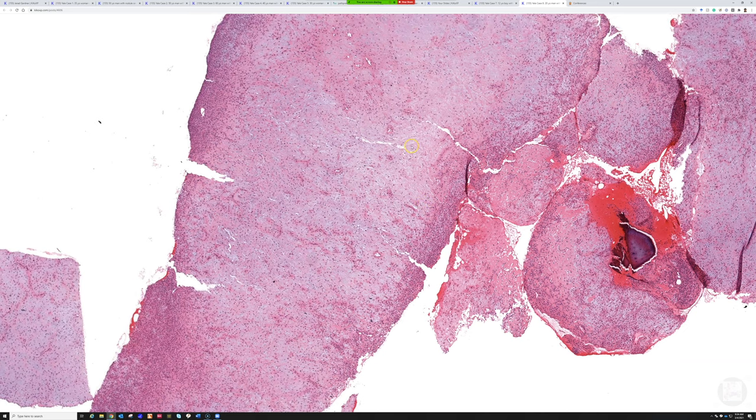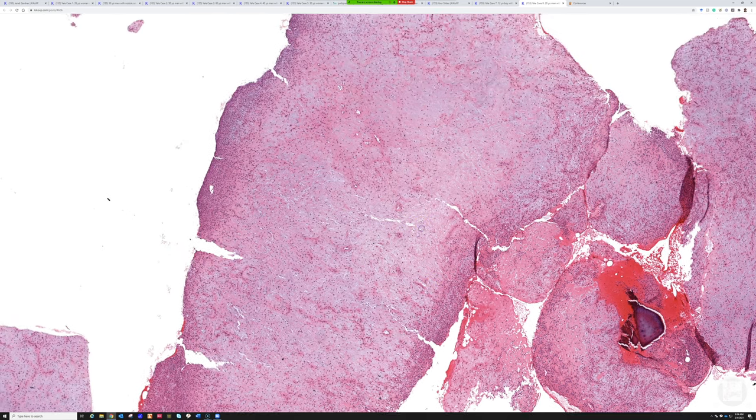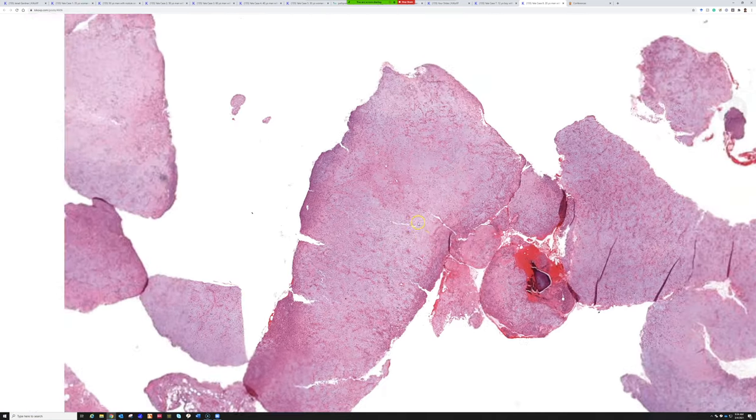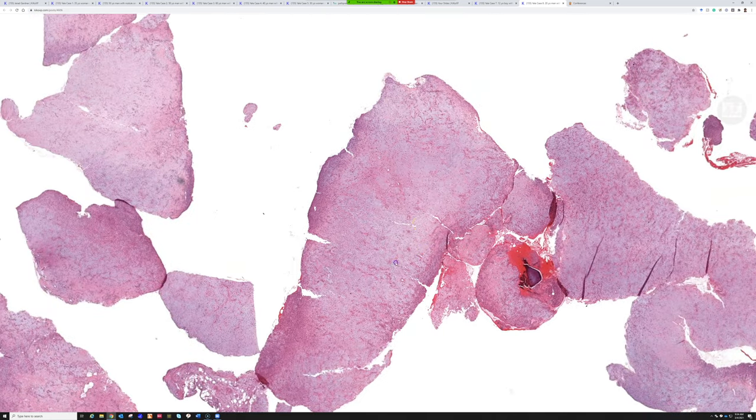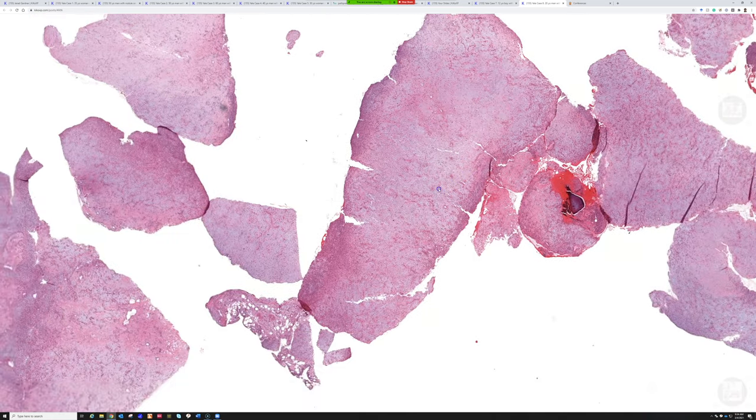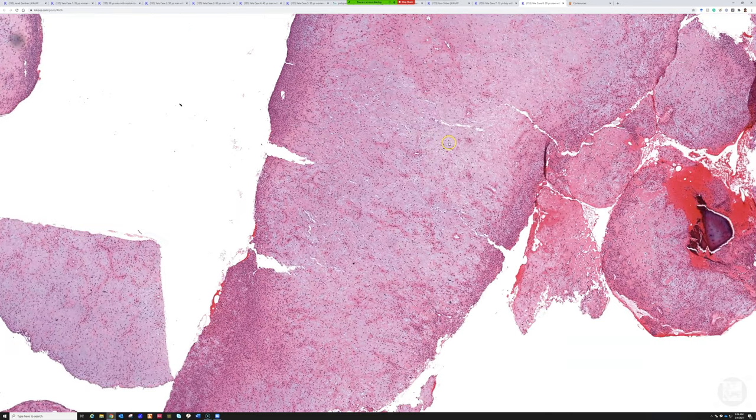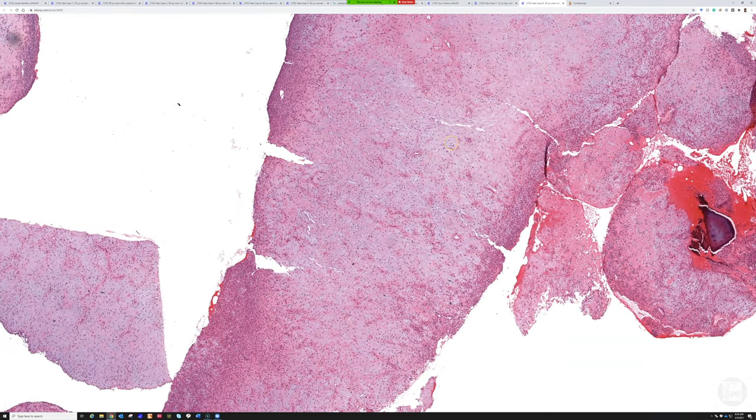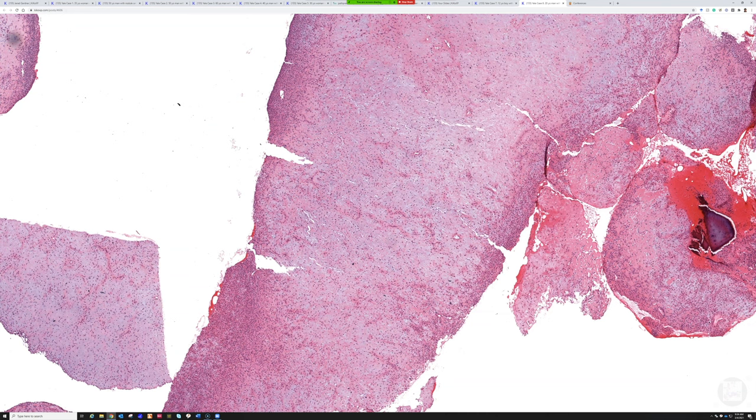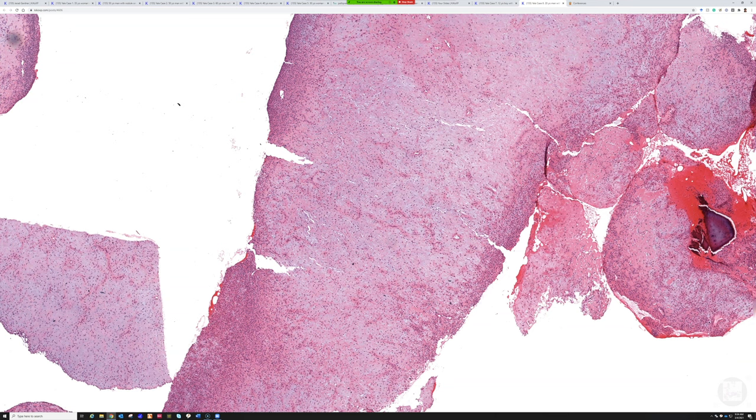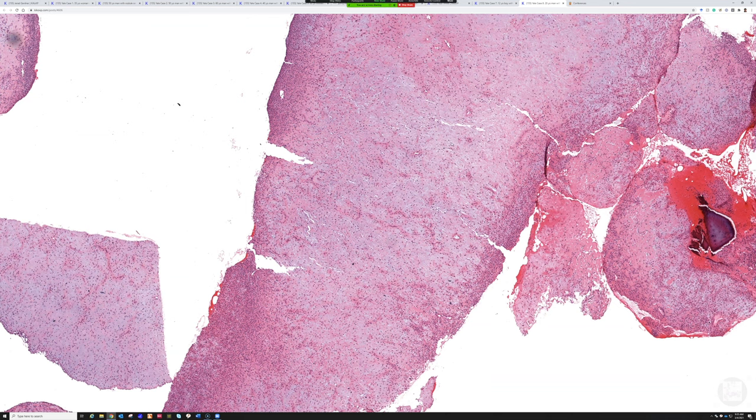Very good. This is a really nice chondromyxoid fibroma. Even though these are thought to represent cartilage precursors—a little bit less mature than what we see in chondroblastoma—to me it doesn't really look like a cartilage lesion at first glance. It looks like a myxoid lesion. Myxoid and chondroid can overlap.